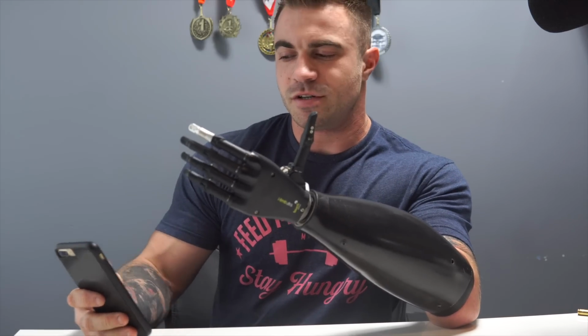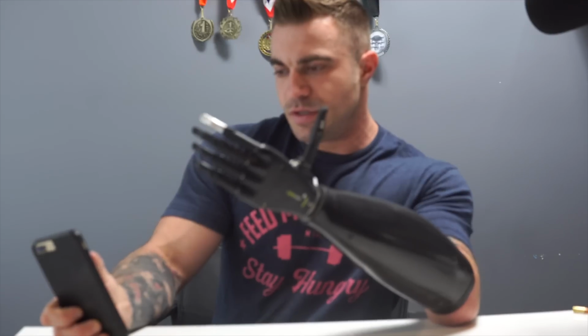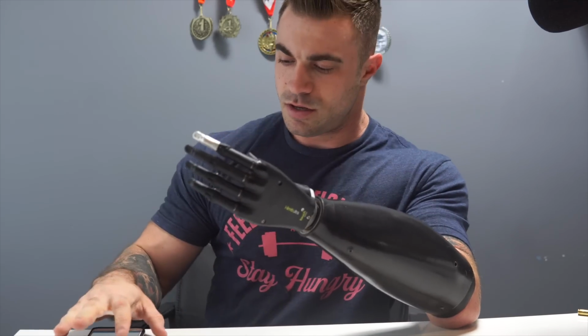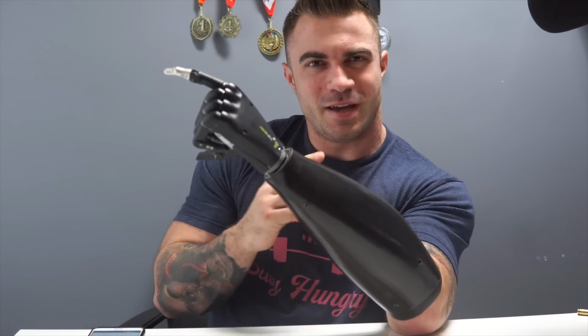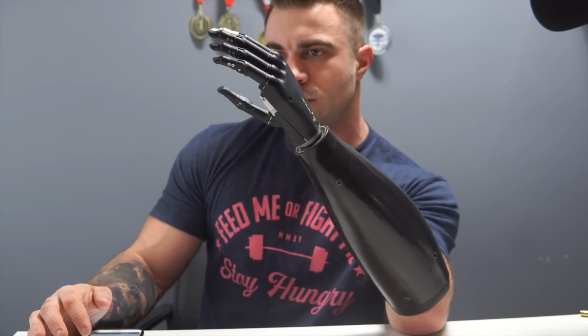Going through some different gestures, I'm going to help kind of control it on the phone, on the app, so you guys can see the graph and all that. So this is a standard precision pinch. I have to adjust this here. You guys can see it. It's difficult to do when my elbow is bent. I'm not used to contracting the muscles like that. This is a thumb precision pinch. I guess it just keeps the thumb in that position, and then you can just move the finger to it, which is weird.